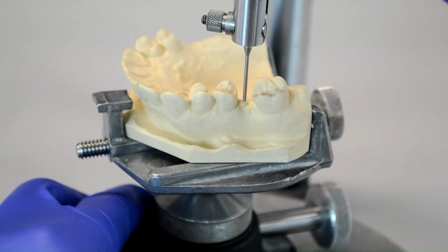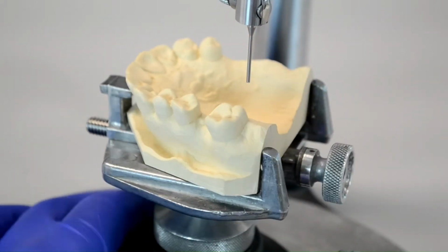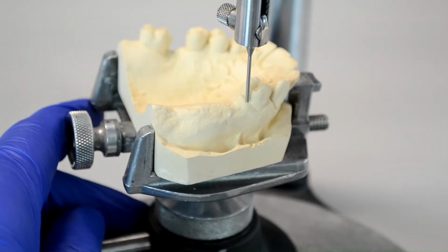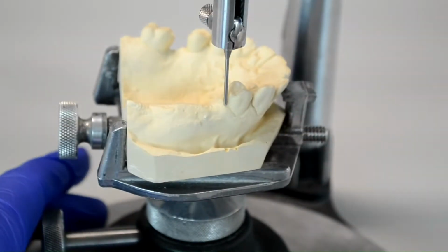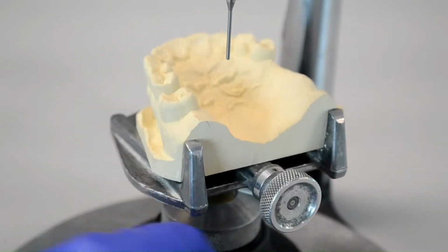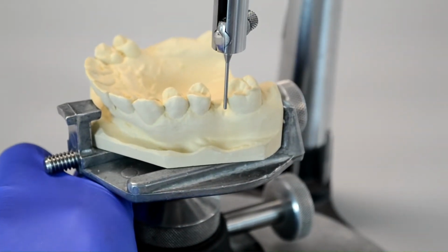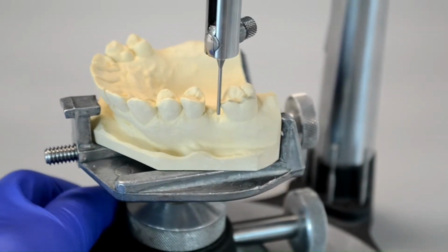The goal of analyzing the cast is to identify a path of draw that would require the least amount of adjustment on the guide plane areas. The ideal path of draw would require even adjustments on all abutments, rather than no adjustments on some abutments at the expense of the others.